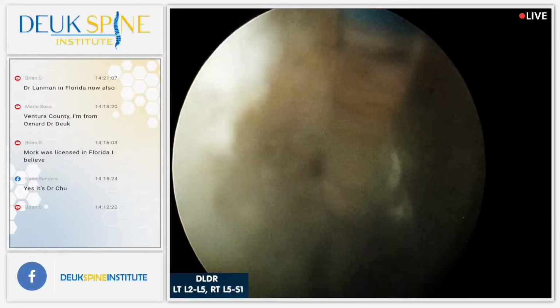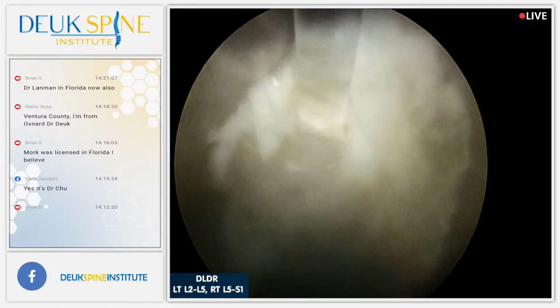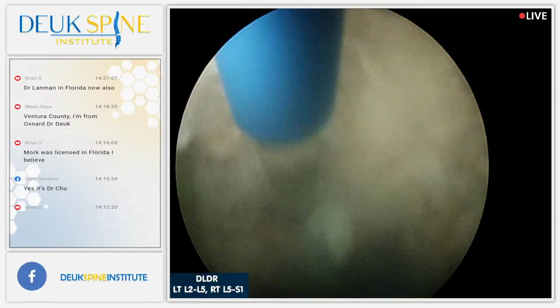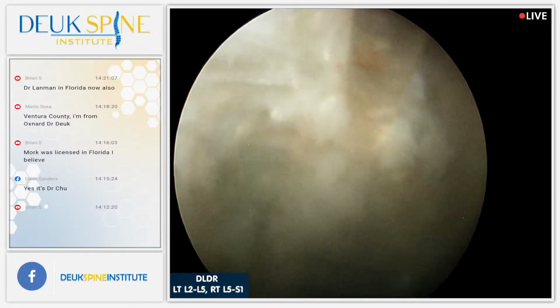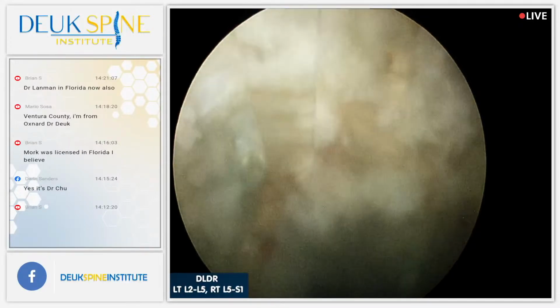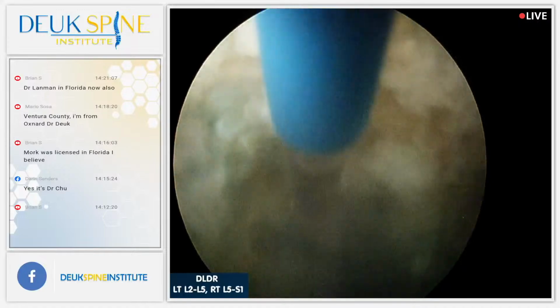So it's kind of like the old days, Red Rover, send Johnny over, and you would be sitting there on a line holding hands with the other kids, and somebody would come over and literally smash right through your bond, which is your hand holding. The laser energy basically does that. It comes out and smashes right through those bonds holding the amino acids together, the primary protein structure together, and it basically breaks proteins up into lots of little pieces.